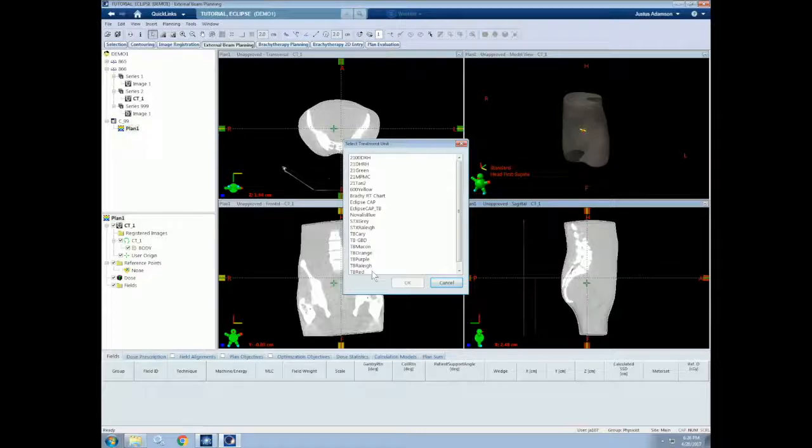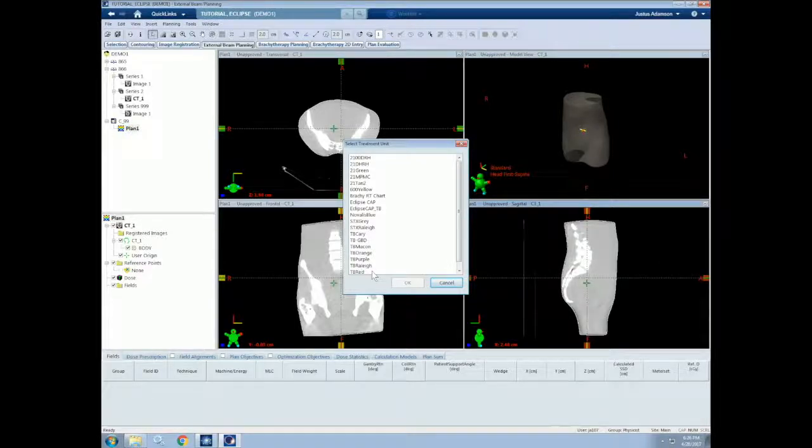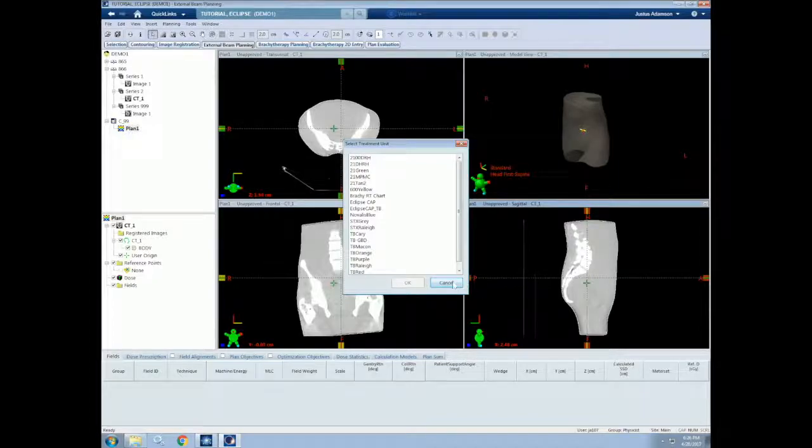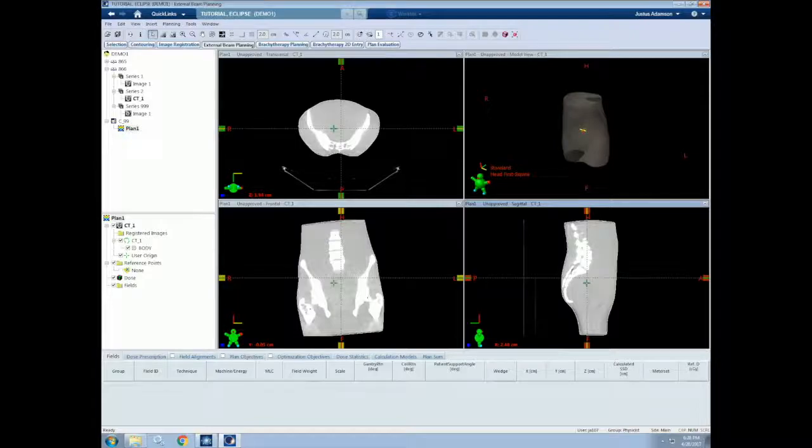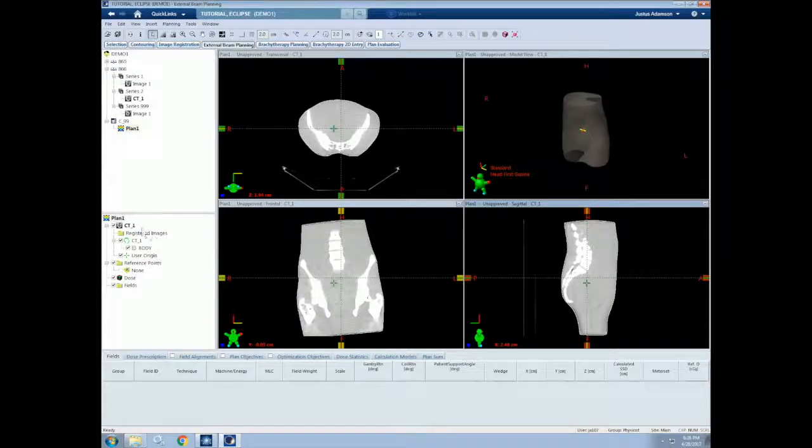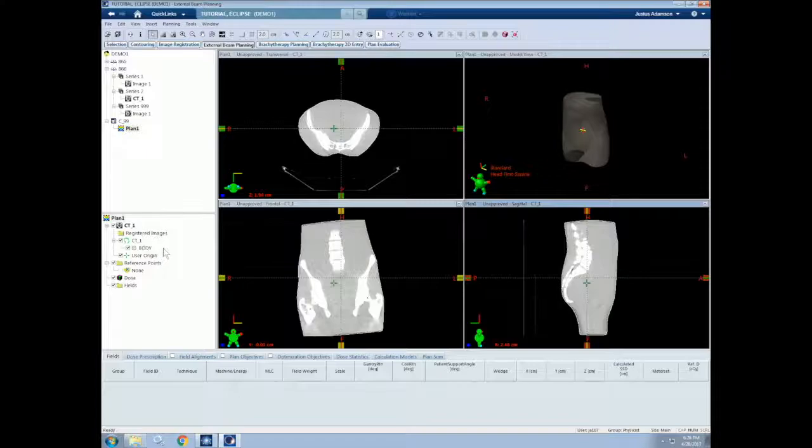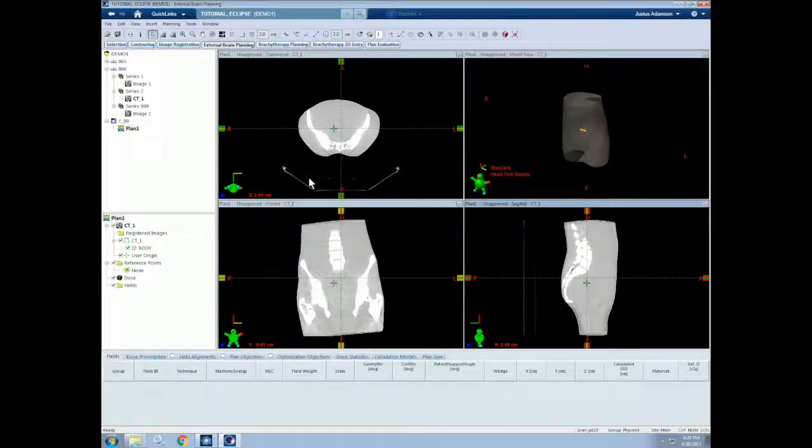Directly after creating a plan, we'll be prompted to insert our first treatment field. We do not have to do this right now, however, so we will cancel for now. Once our plan is created, we can see the images and structures associated with our plan down here on the left side. This will be your treatment planning interface and should be familiar to the first tutorial video.